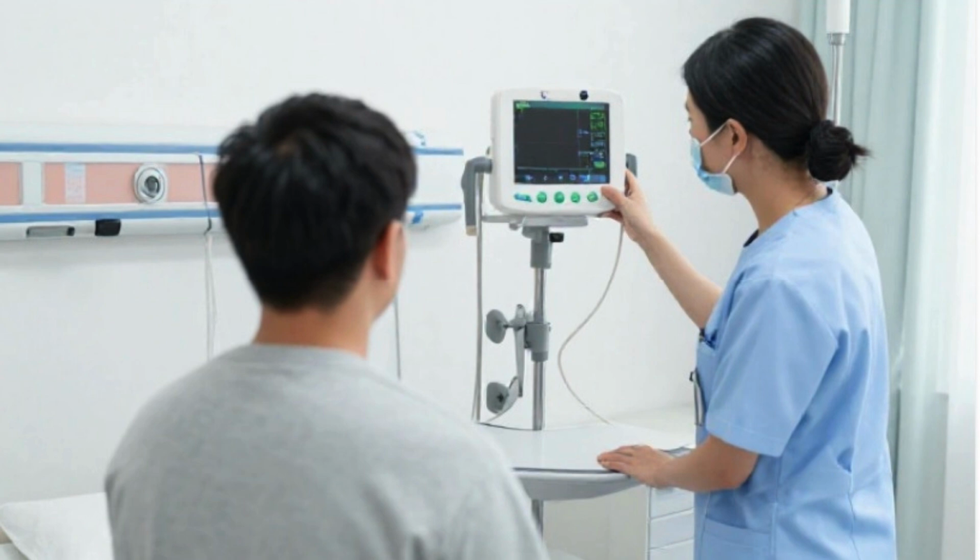Once the sensors detect the physiological signals, the signals are transmitted through patient cables to the monitoring unit. These cables must be in good condition to prevent signal loss or interference. Damaged cables are a common cause of monitoring errors, which is why regular inspection is an important maintenance task for electromedical technicians. Inside the monitoring unit, the signals undergo amplification and signal processing.